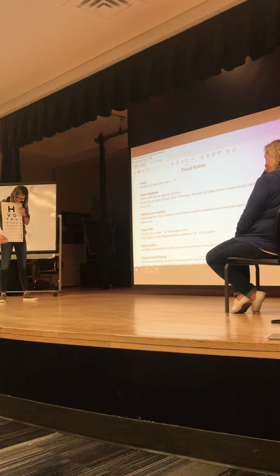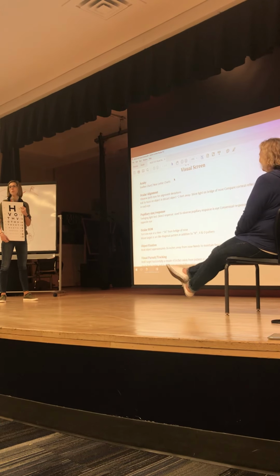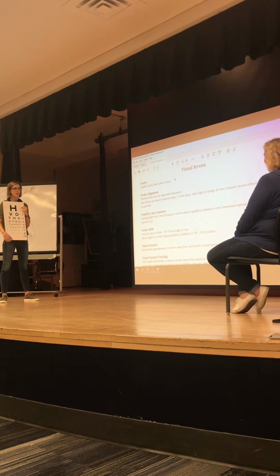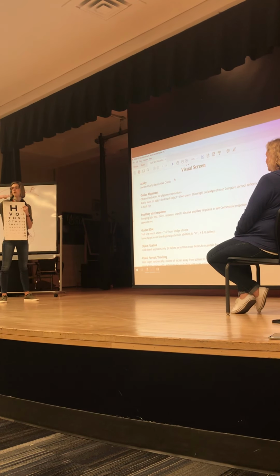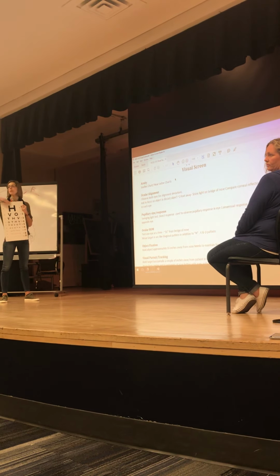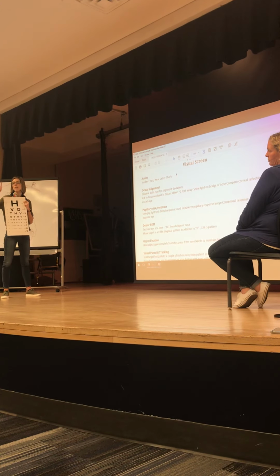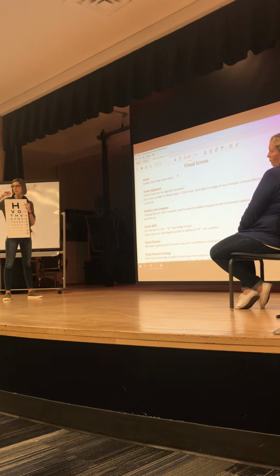T H V O T V O H T. Okay, so she did actually very well. She did all but one. So I would say she was 20 minus 1, meaning that she had one error. When you read the line, you can have up to 2 wrong. So I can write 20/20 minus 2, 20/40 minus 2, 20/60 minus 1. They get credit for the line if they get all but 2 correct.